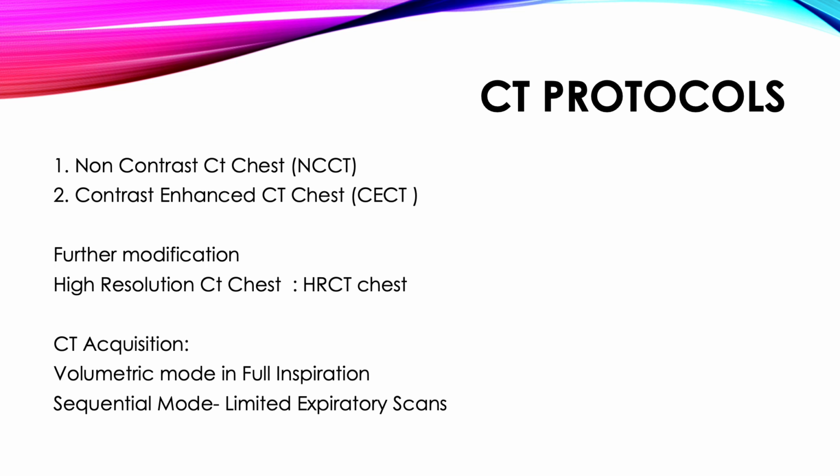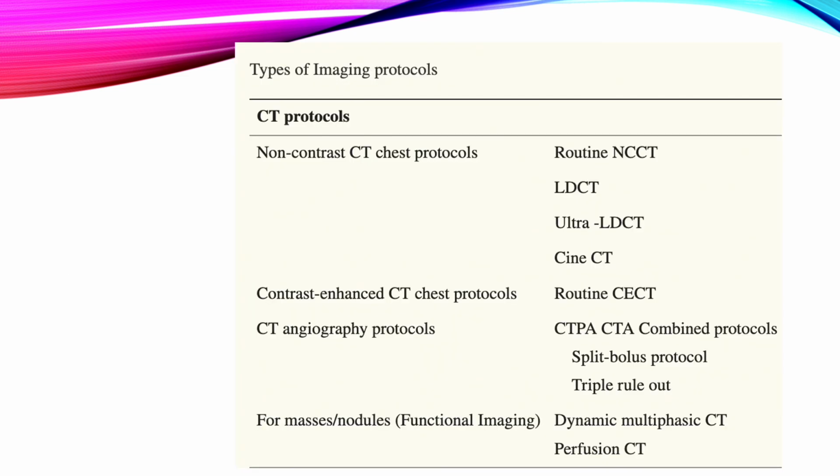Now, since CT scans or computed tomography form the workhorse of imaging evaluation, it's very important to know where, which scan and which protocol needs to be ordered, because there is an increasing concern of radiation exposure, especially in young individuals. And since we're using iodinated contrast material in a lot of patients, we should be more wary of whether contrast is actually required, especially when you require repeated imaging. So, what are the imaging protocols?